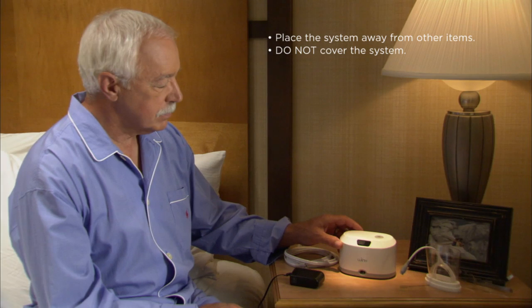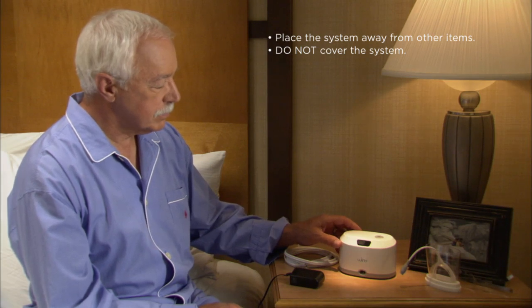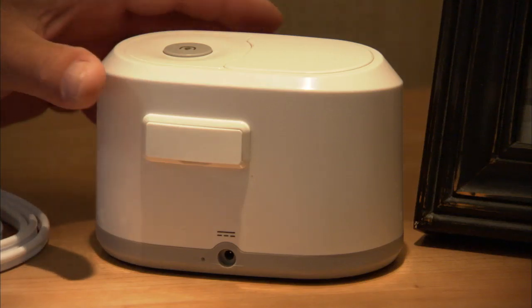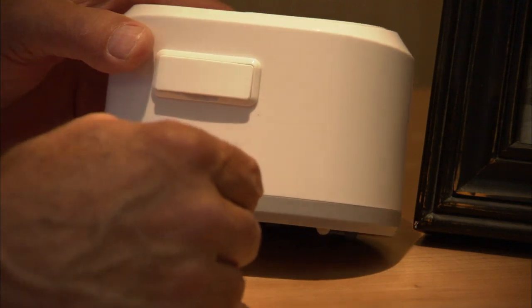Start by placing the console on a level surface, such as a nightstand or the floor, close to the bed. Plug one end of the power cord into a standard wall socket, and connect the other end to the back of the console.